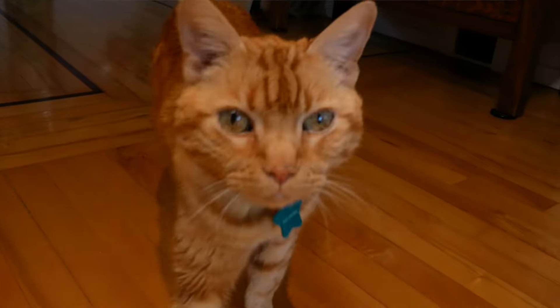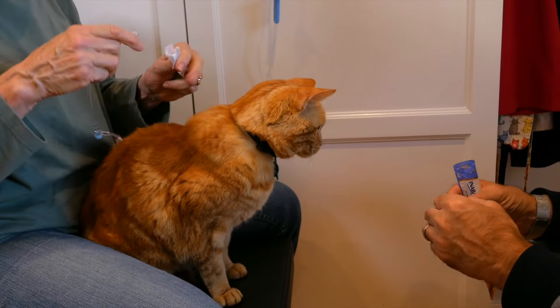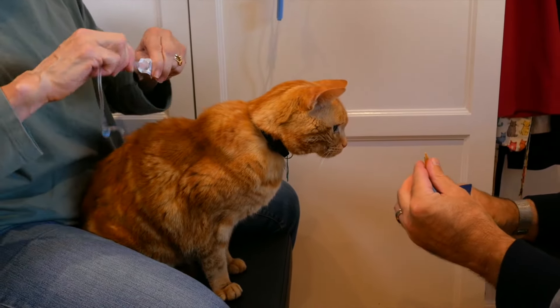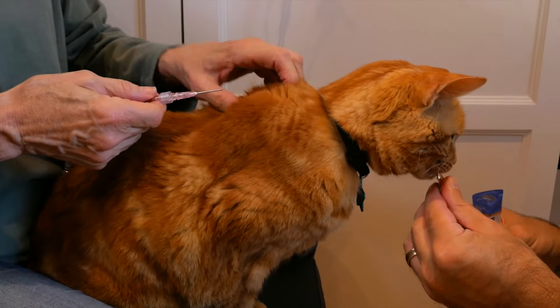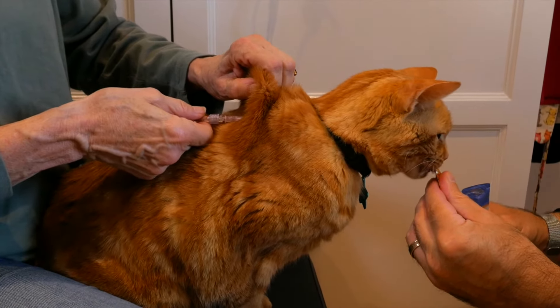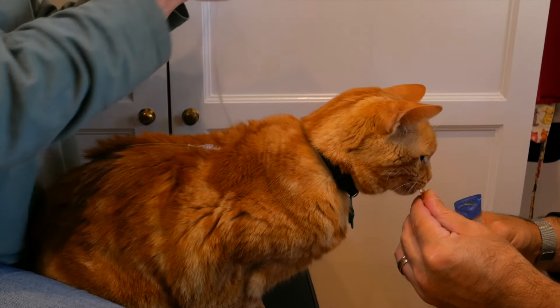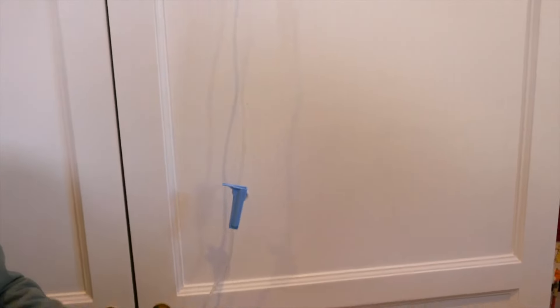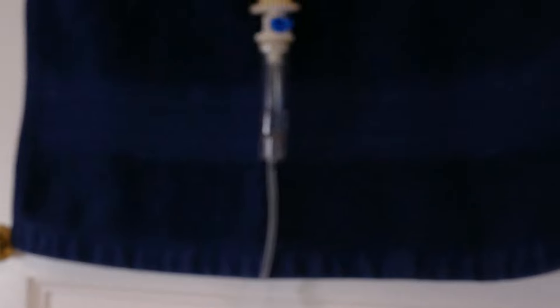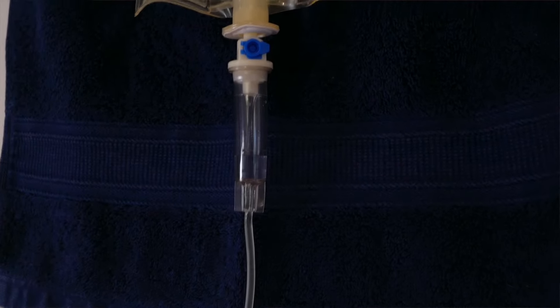This is Nimitz, and Nimitz actually comes every evening when he knows it's time for his fluids. He's very keen to get them because he associates his fluids with receiving churu. He's happily eating. I'm going to lift the skin between his shoulder blades and, holding the needle in place, I'm pulling the skin over the needle. Then I need to open the wheel on the valve so that the fluids are running. If the fluids aren't running well, I'll rotate the needle and check — the fluids will run much more quickly when the bevel isn't up against any tissue.